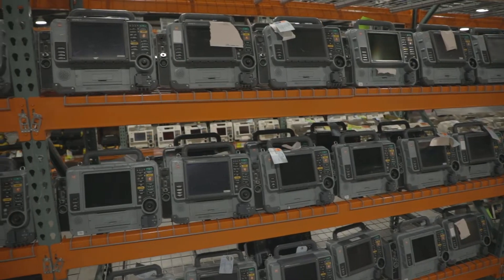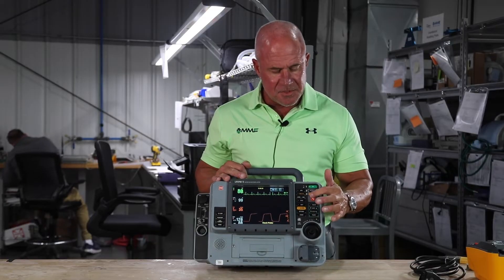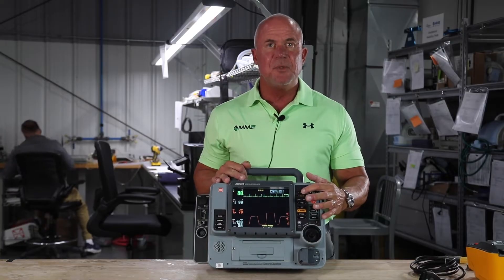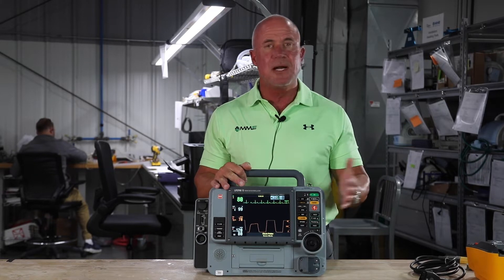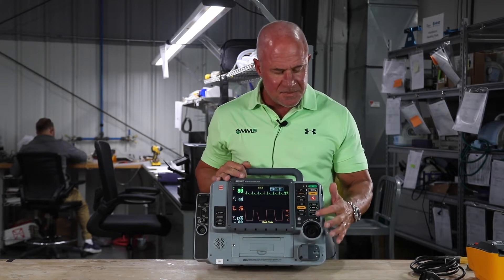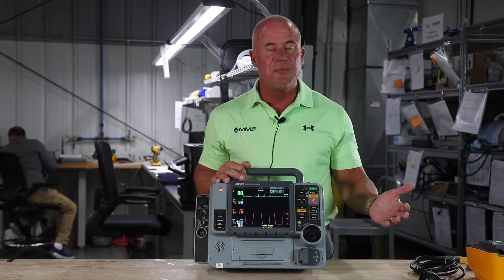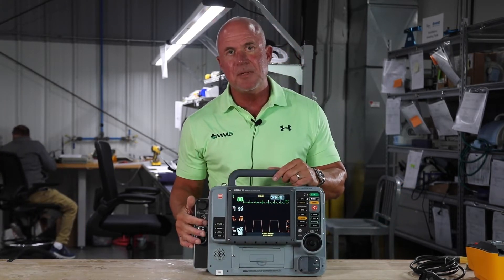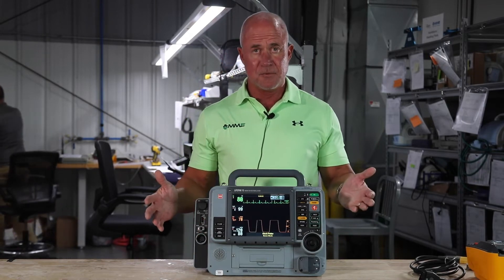We offer this monitor in a lot of different configurations including manual defibrillation, an AED mode, a CPR metronome to help guide you to properly ventilate your patient without hypo or hyperventilating, pacing, synchronized cardioversion, non-invasive blood pressure or invasive blood pressure, 12-lead capability, and a way to manage your data or your call run on the back end.